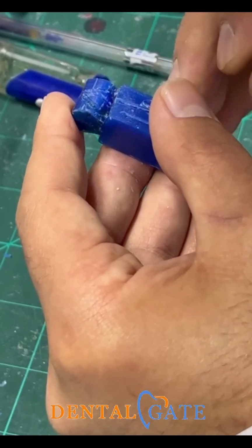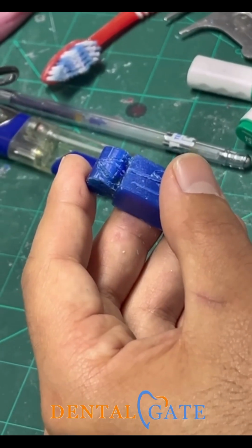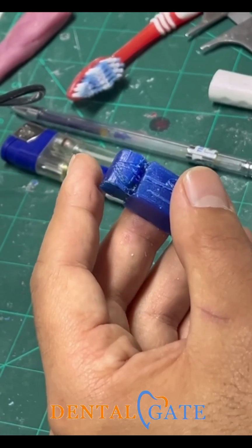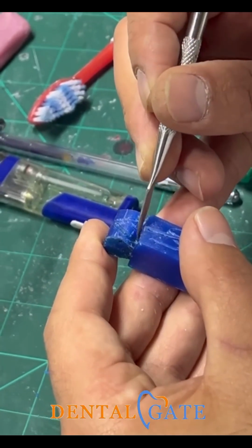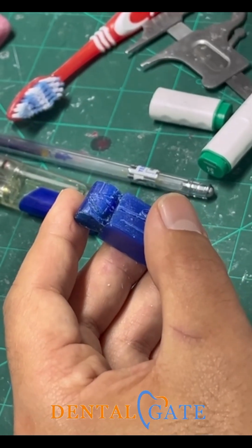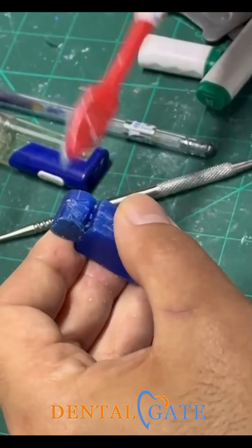I need the maximum width at the distal aspect or the mesial aspect to guide me for a proper distance, a proper volume, a proper shape to the lateral. I will adopt my information about the carving, about the anatomical landmarks of the lateral incisor. So this is very essential to preserve the shape of the lateral, to maintain the maximum width, the maximum convexity, the maximum concavity. So this is the maximum convexity here. This is the concave shape here until it reaches the top of the block.